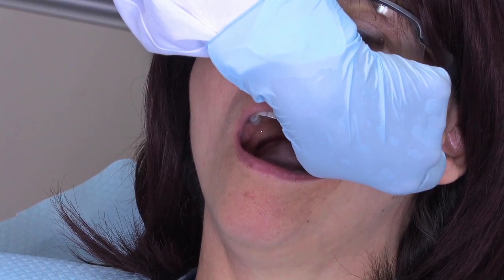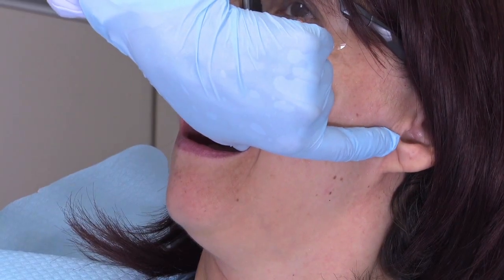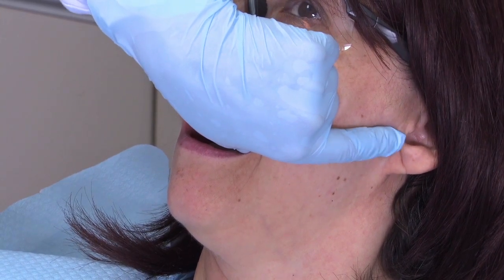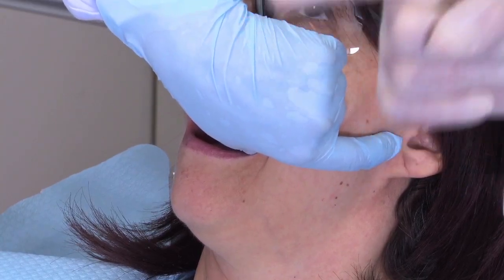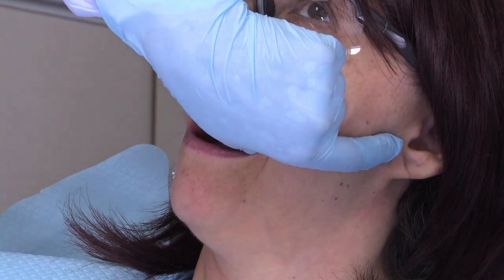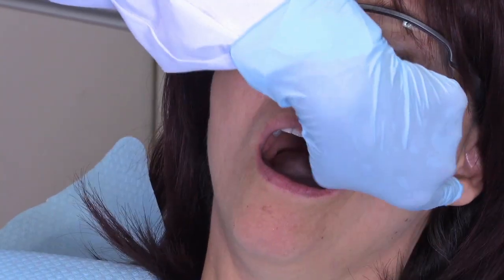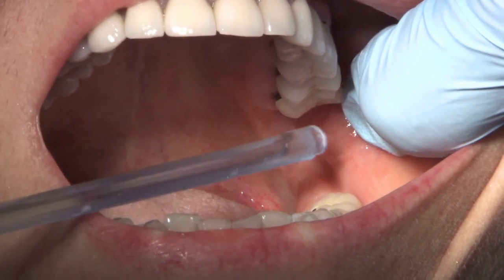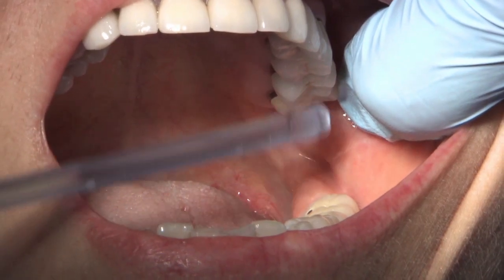Then when I turn her back around, I know where my finger is, and it's going to be a mental image as if I am aiming for my finger, because my finger is right next to the condyle. So over here where I'm moving my finger, that's my target height — where my penetration is. It's kind of like having a finger here and starting over here where you can't see it, so you'd have to turn your head and try to bring your two fingers together. Exactly — like a roadside sobriety test. So when I come in, I want to choose the height of my penetration in respect to the mesiolingual cusp of the molar.